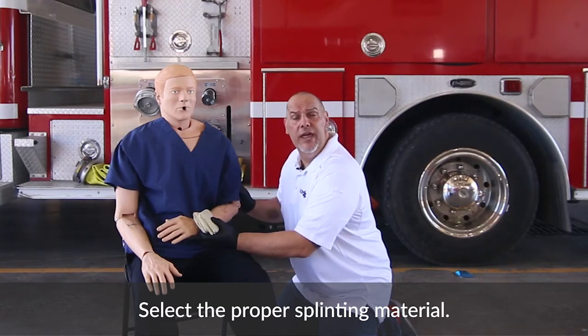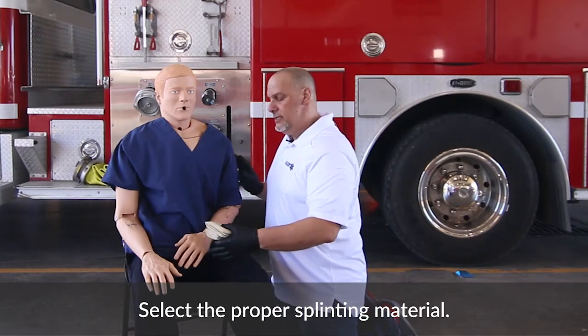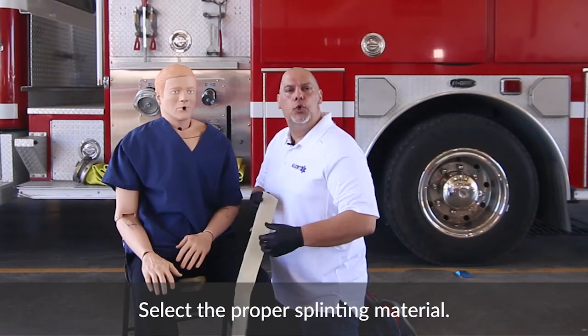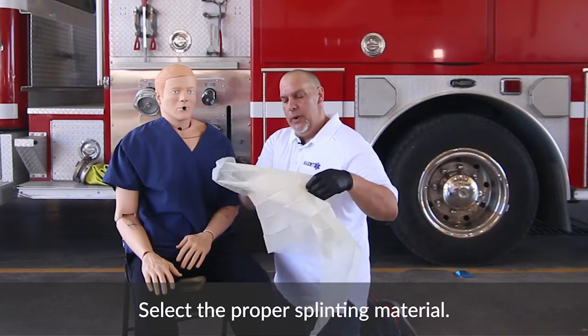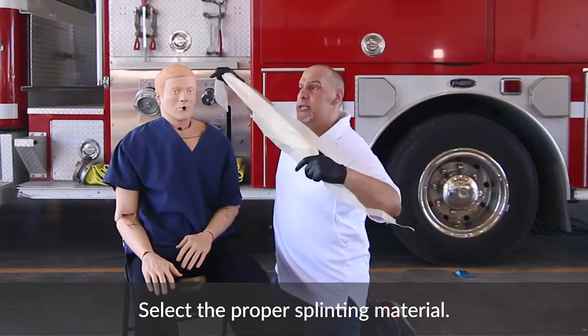What you want to do now is pass this off to your partner — they hold manual stabilization while you choose the appropriate splinting device. We're going to use two triangular bandages. Now it really is kind of an old-school way of doing it. There are a lot of things on the market that you may have in your departments, but we're going to use our triangular bandage.